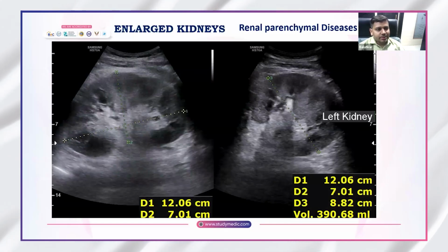And what is known as acute renal disease, in which case of acute renal injury, it may be because of some infections, or because of uncontrolled diabetes, or maybe bilateral pyelonephritis. So the kidneys will be bulky and hypoechoic now. They will not be echogenic. They will be hypoechoic. Again, the differentiation between the renal cortex and medulla will be reduced, but the kidneys will be very bulky. You can see a kidney of size 12 centimeters and above. The AP dimension of the kidneys in hypoechoic bulky kidneys will be 6 centimeters and above.